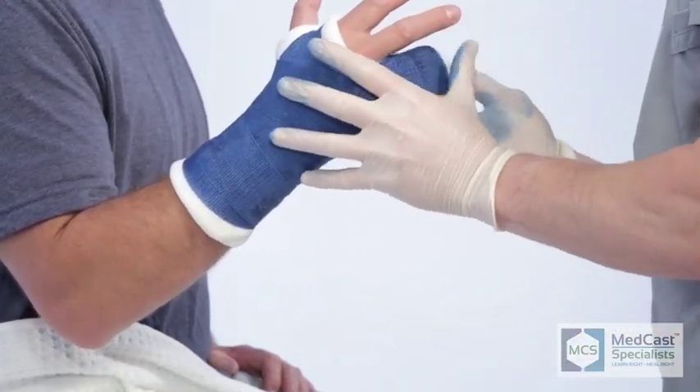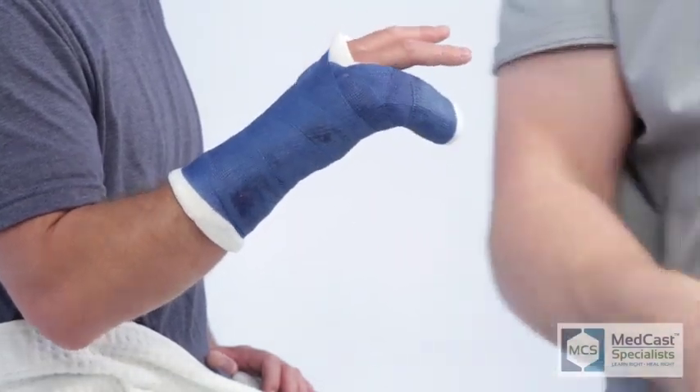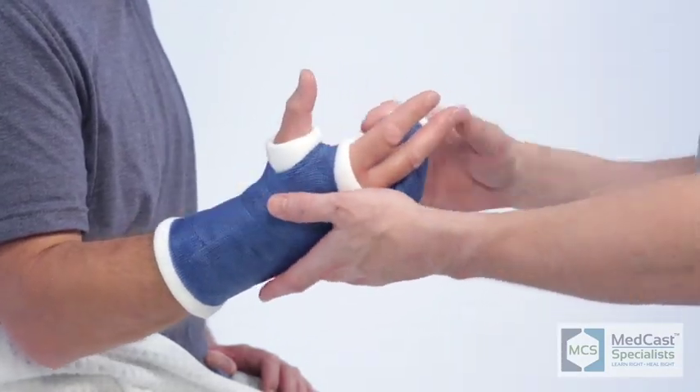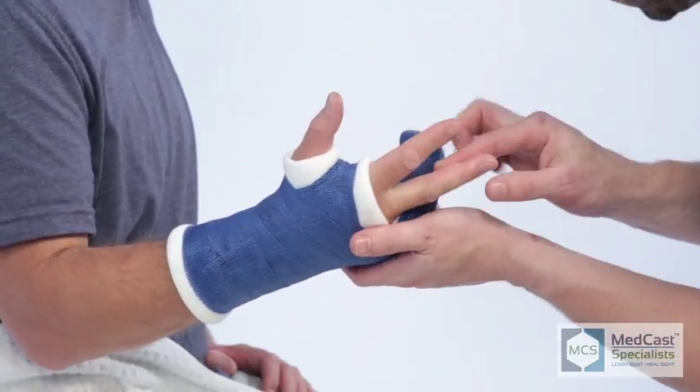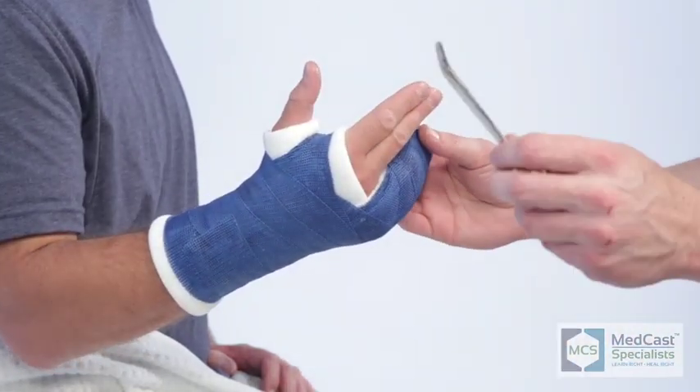This is a very good technique using just one roll. A lot of times when we're training other cast technicians in our facility, we'll send them home with ace wraps — especially for the ulnar gutter, send them home with a few two-inch ace wraps and tell them to go practice on someone. Get the rhythm down so they feel comfortable when it comes time to do an actual cast application.